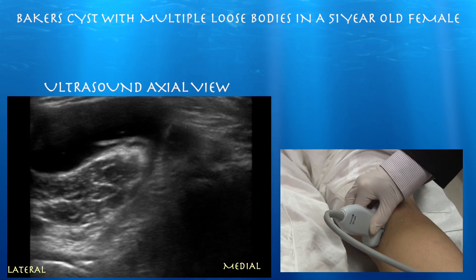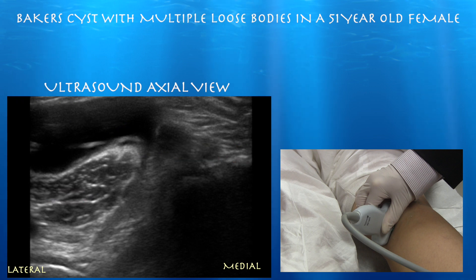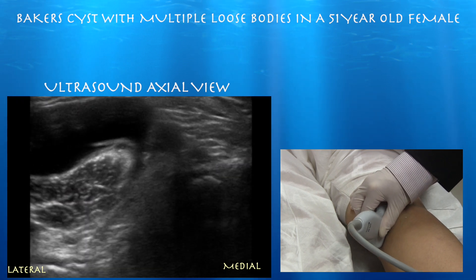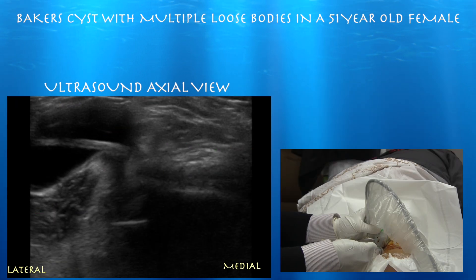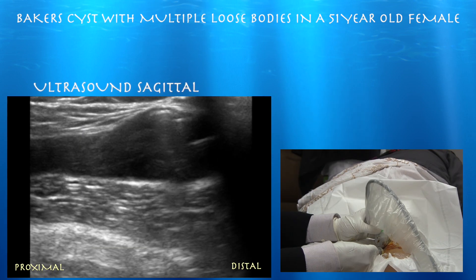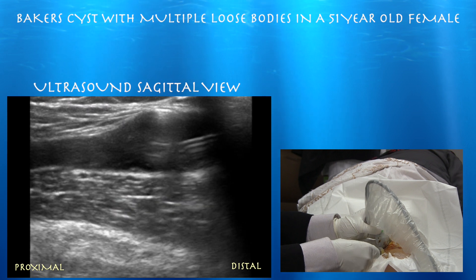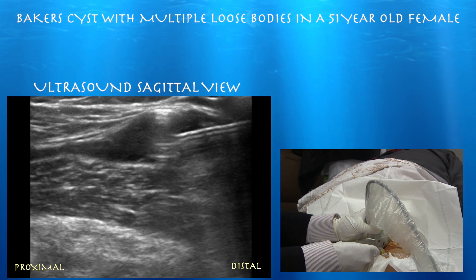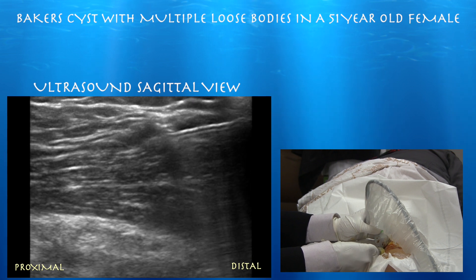One thing you don't want to do — you can look at the cyst and think that little black circle next to it is part of the cyst. It's really anisotropy of the semimembranosus tendon. There's a really nice view of the knee with the septum going across the cyst. And we're going to start our aspiration. There's a nice reverberation artifact of the needle and cysts drain pretty easily. You can see how the tissue converges around the needle, and ultrasound can help you keep your needle within the actual cyst while that tissue converges around it.